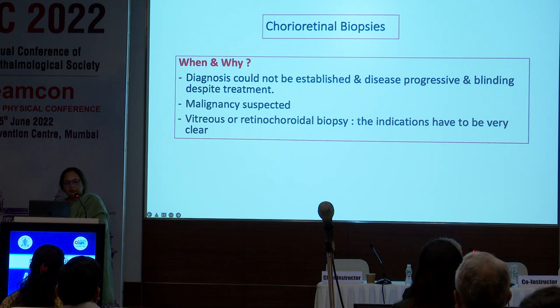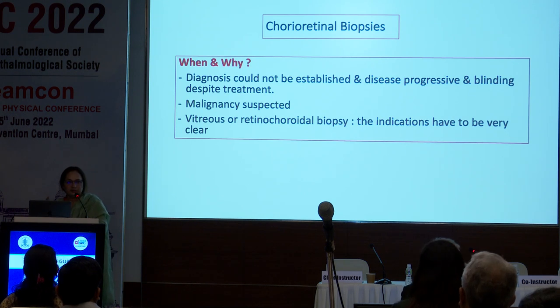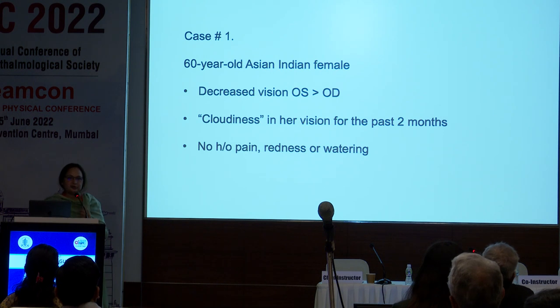And you have to be very clear what the indications are for doing a vitreous biopsy. Like somebody was asking a question, what is the indication for TAP? What is the indication for vitreous biopsy? And then what is the indication for chorioretinal biopsy? Because they are not interchangeable. So before we actually move on to choroidal biopsies, I'm going to show you three examples and three techniques in the context of lymphoma, because that is what we all come across.